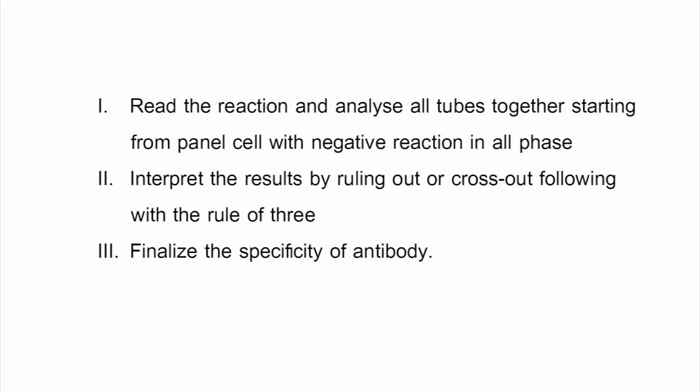Read the reactions and analyze all tubes together, starting from the panel cell with negative reaction in all phases. Interpret the results by ruling out or crossing out, following the rule of 3. Finalize the specificity of the antibody.